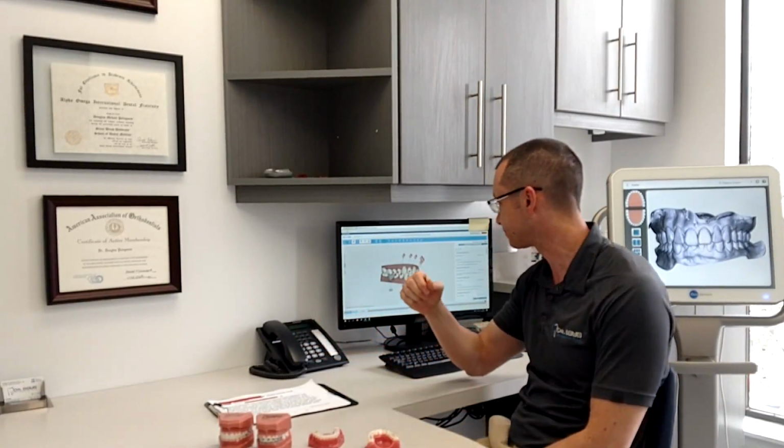That by no means means it's going to work in the patient's mouth or is even achievable. That's where the doctor's role comes in. So we submitted our instructions based on what the patient told us and what we think should be done. And now we're going to refine this. We're going to zone this in and make adjustments on the initial ClinCheck until we're happy that it achieves all our goals that the patient wanted to achieve and that us as doctors wanted to achieve for the patient.